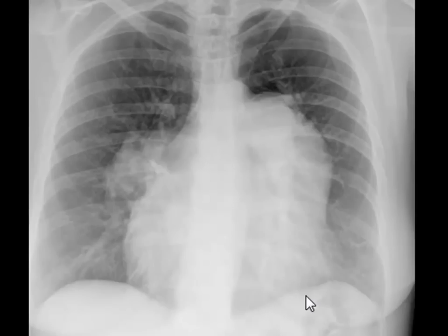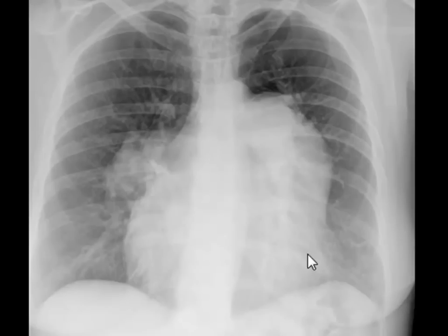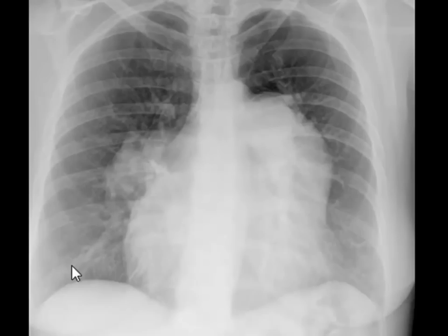This X-ray is a very good example of the condition, showing almost all the radiological features of pulmonary arterial hypertension. The two main features are right ventricular hypertrophy, which is usually clearly visible on a lateral chest X-ray — unfortunately we do not have a lateral view — but you can see the cardiac size is enlarged, and the right and left pulmonary arteries are dilated, tapering sharply as they go into the lung parenchyma, which is the second radiological feature.